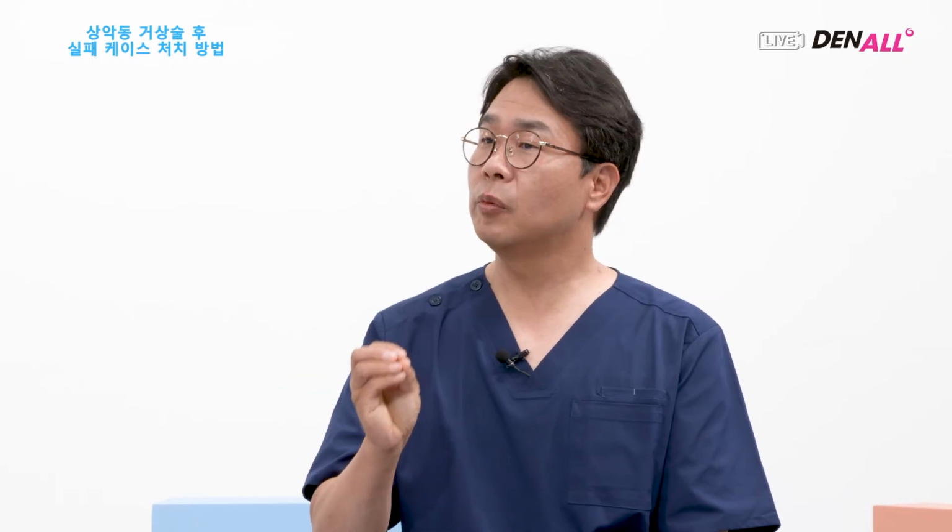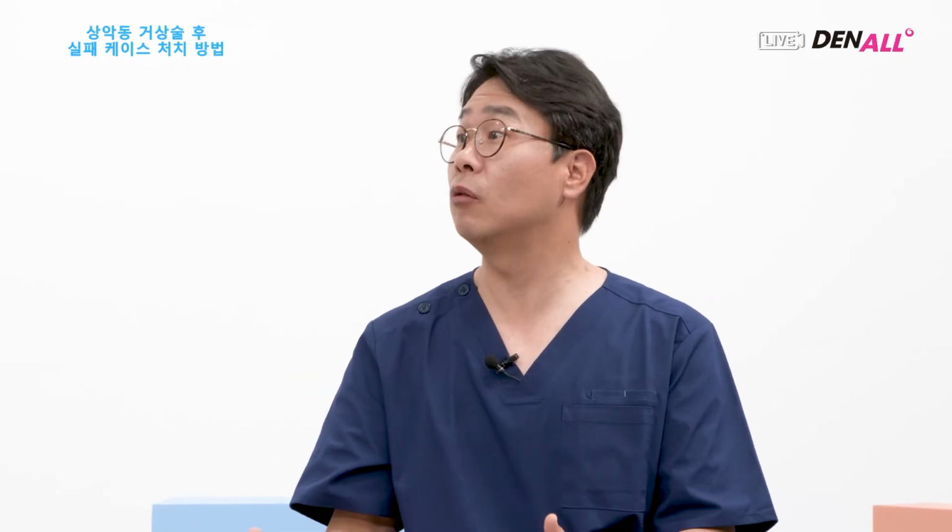During surgery, if we invade the nerve, it's a different story. But when the sources of pain are removed and still the patient complains of pain, it will put the dentist under a lot of pressure. Right? Augmentation surgery is a big deal, and removing an implant itself is causing a lot of damage. So as you said, during the waiting time, what do you prescribe?